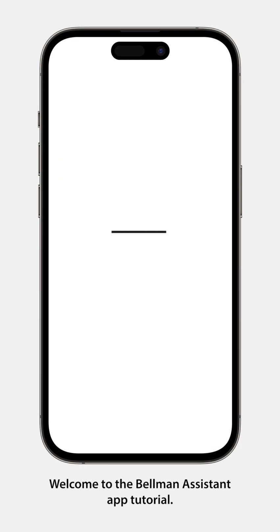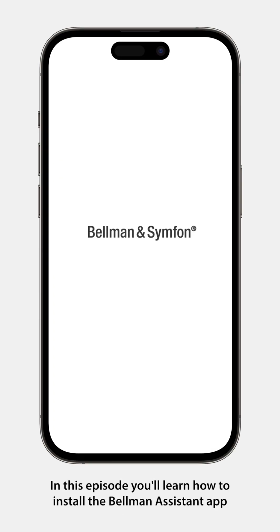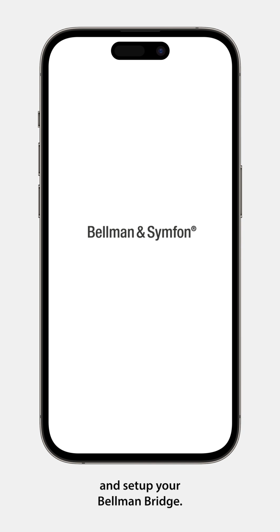Welcome to the Bellman Assistant app tutorial. In this episode you'll learn how to install the Bellman Assistant app and set up your Bellman Bridge.